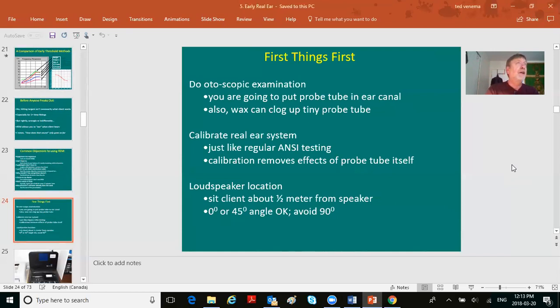Anything, according to any disinfectant thing. You go to any workshop, you never wash insert headphone tips either. You can't. They're made out of sponge, and you can't clean out all the cavities. Bad news. Anyway, otoscopic exam.